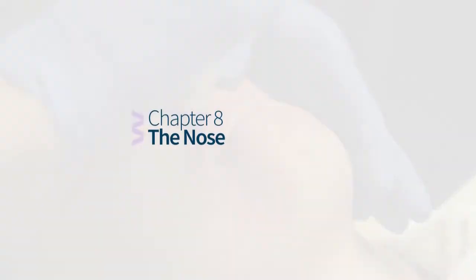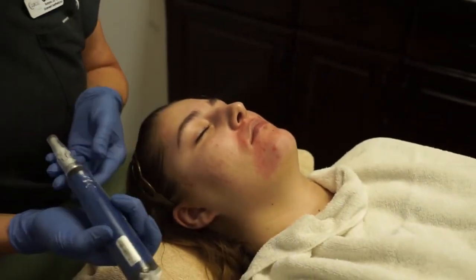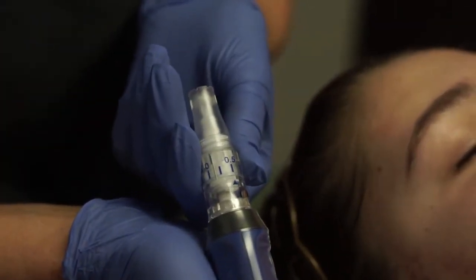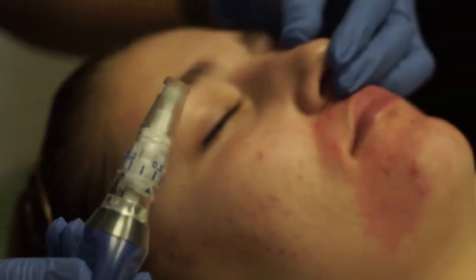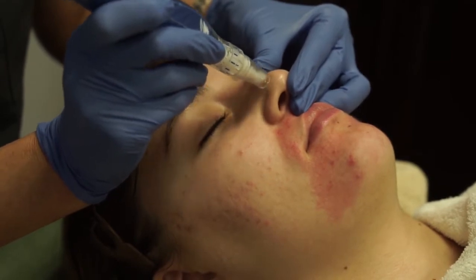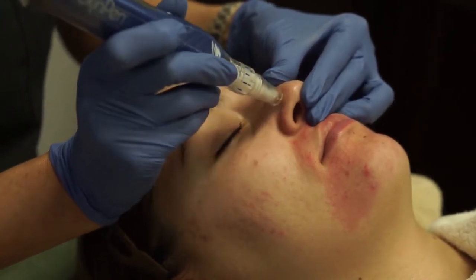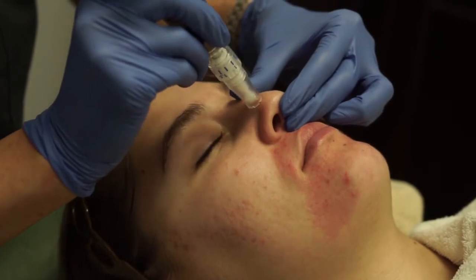The nose. When treating the nose area, you want to dial down the depth. In the case of this patient, we moved the depth dial from 0.75 millimeters to 0.5 millimeters. Gently hold the nose stationary on one side as you begin to treat the other side. Holding the nose with light pressure, like this, will help quell the vibrations, which can tickle a little, so be sure to let the patient know to expect a tickle sensation when you begin treating the nose.